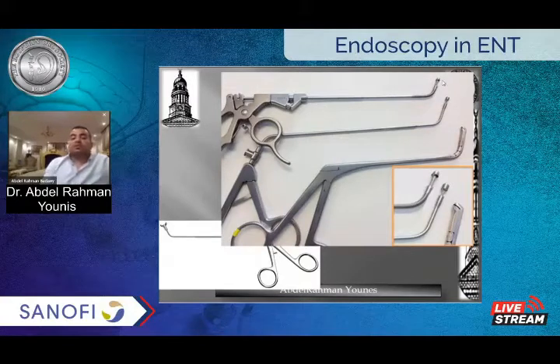before dealing with the frontal sinus, you should take care that you have the proper instrumentation. The frontal sinus differs from any other sinus because you are dealing with it from below. All the bleeding comes from upward and you are dealing from below. If you don't have such instruments, don't go inside the frontal sinus. It's easy to have a frontal sinus clearance or Draf type 1, but if you wanna do Draf type 2A or B or Draf 3, you should have one of these instruments.